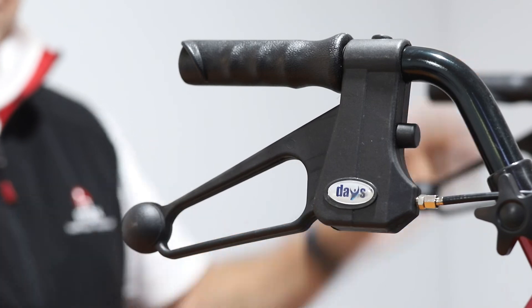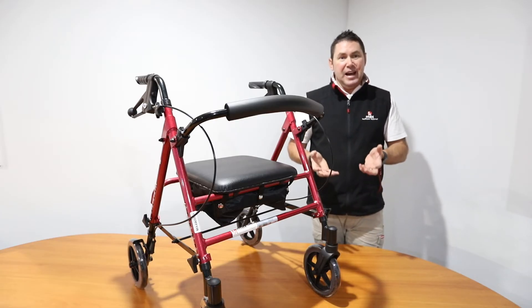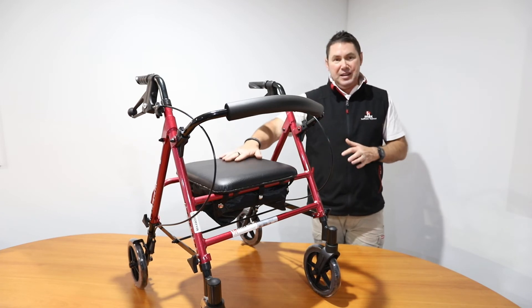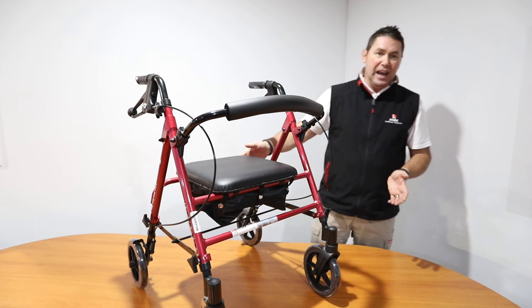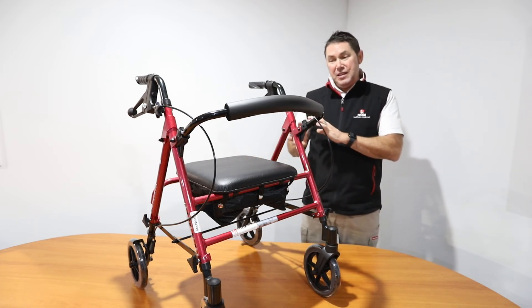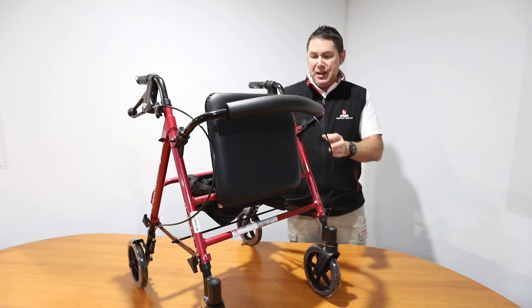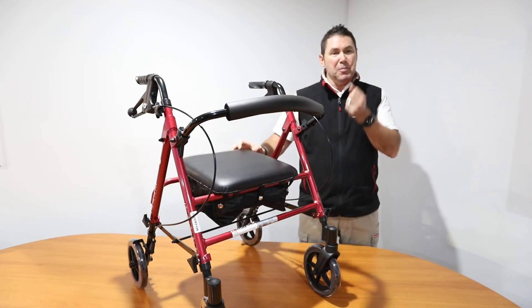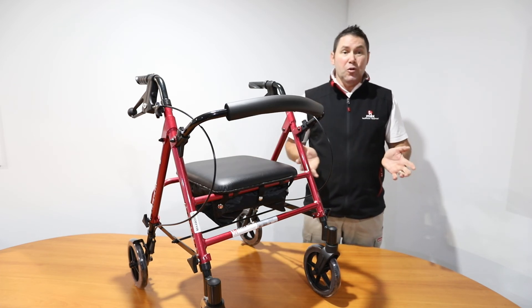That is going to be really useful for when you are using the walker as a seat — take a rest on this padded seat here. Below the seat is a handy and generous storage compartment, and within it there is a strap that is used to pull up and fold the walker for storage or transport.